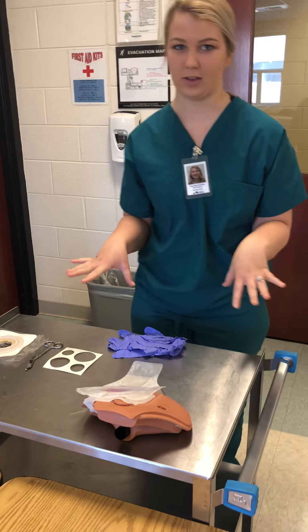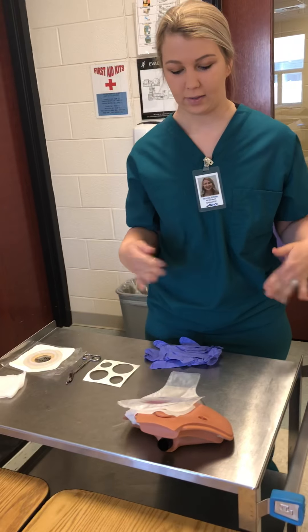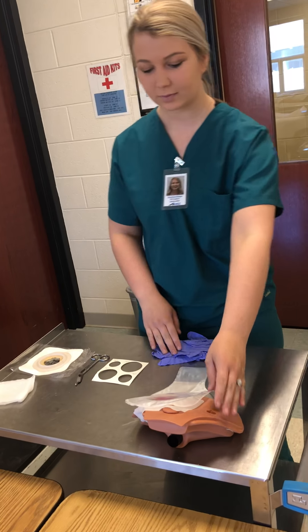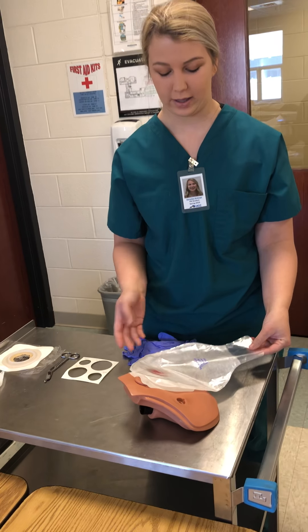So first I'm going to position the patient, whatever is easier for them. So this patient is sitting down. Their bag is half full, so we're going to change it.